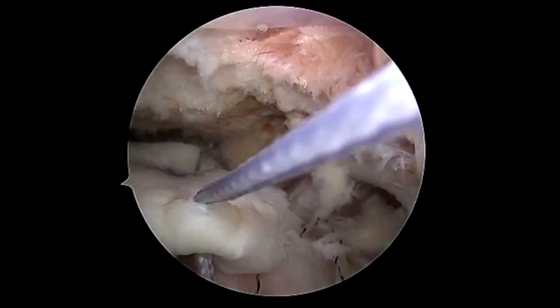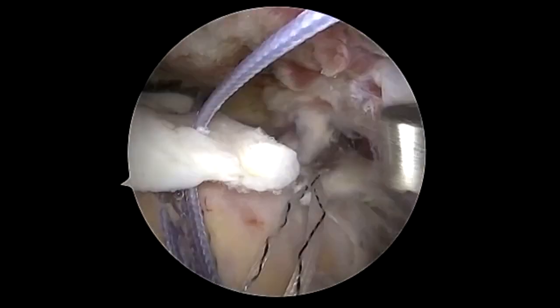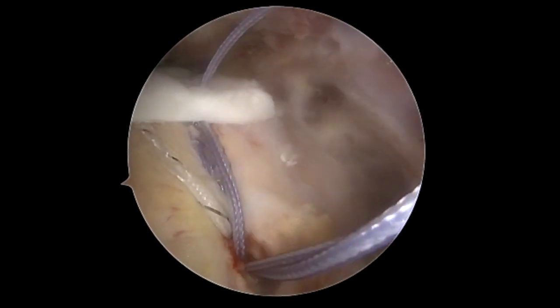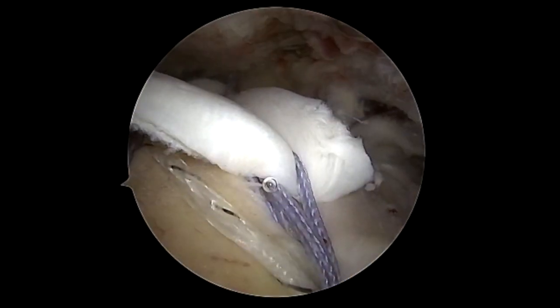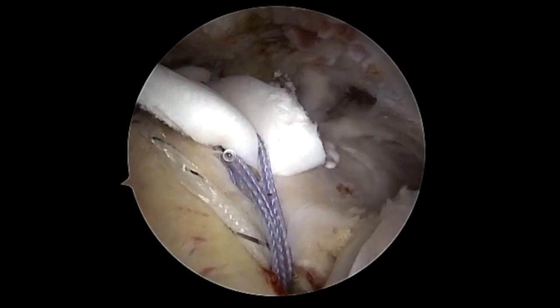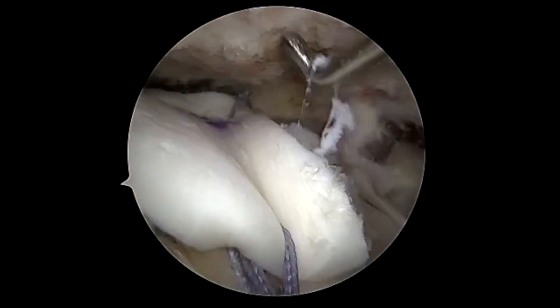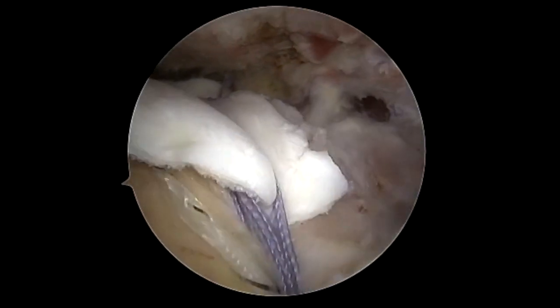We're going to pass the knotless passing suture and then engage this — this is the anterior stitch — and once we lock this down you can see that this patch is quite flexible. This dermal allograft has really nice properties that allow you to tension it nicely along the cuff, and you can see we're not doing any damage to the anchors around that area and we're using the original anchors we have.